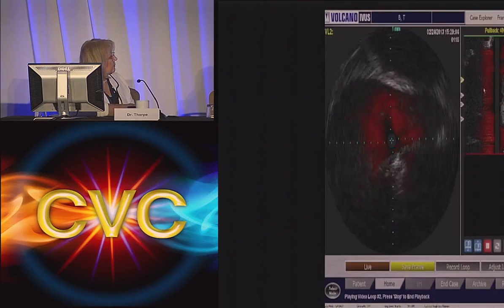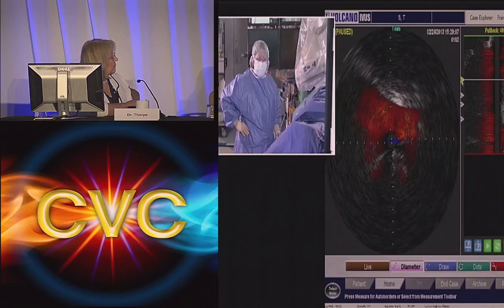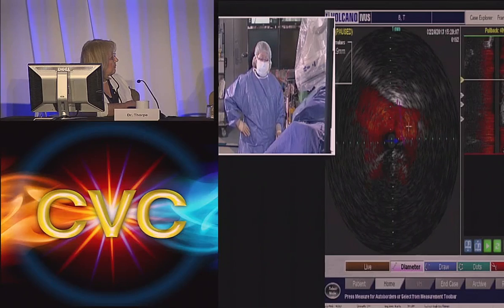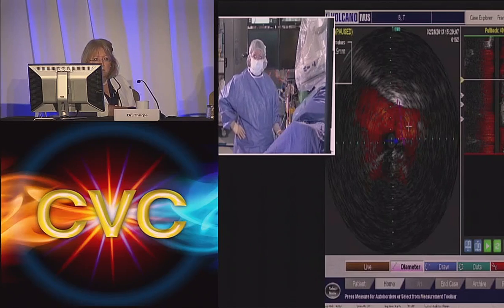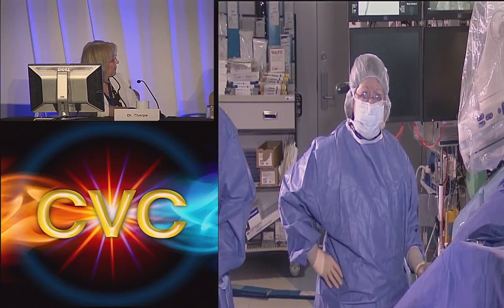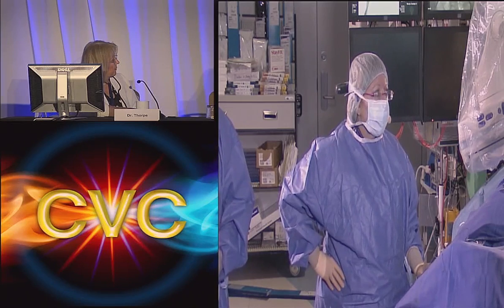So now we're doing the IVUS, and you can see it gets very narrow in the common iliac. So it's about 2.5 millimeter minimum diameter, but it measures about 14 to 15 on the longitudinal axis. So this is a good patient that has a definite compression greater than 50%. And of course she's supine now, so when she's upright, it could be even more of a compression and evidence for May-Thurner. She doesn't have very many collaterals, but we could force the collaterals with a Valsalva, but she's comfortably asleep thanks to Kevin Olina.